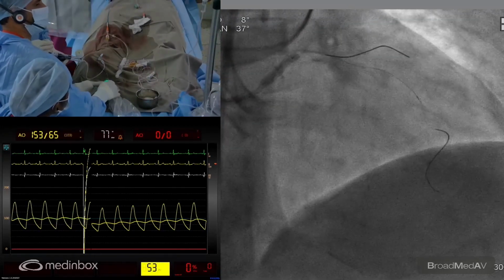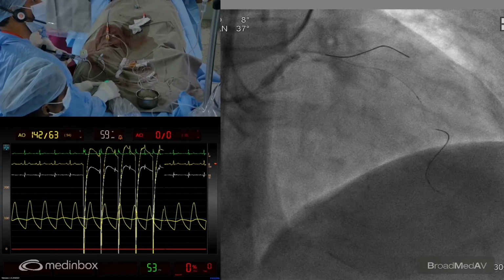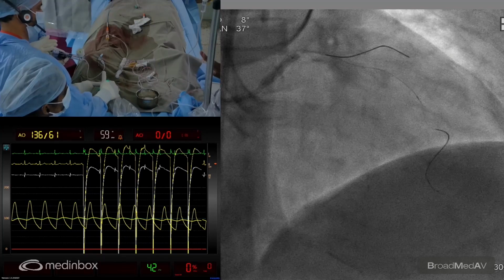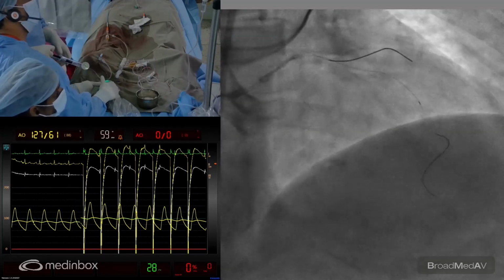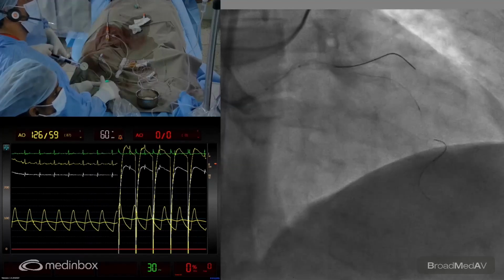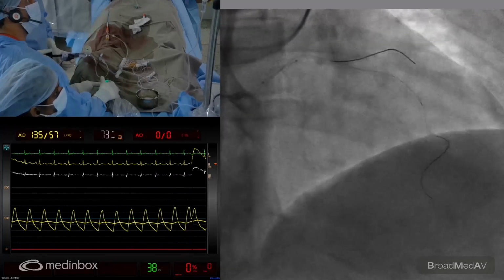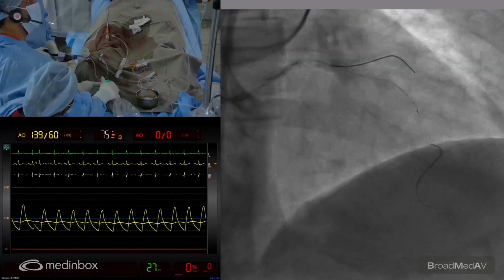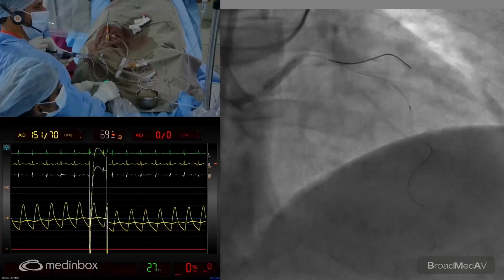Yeah, we are up to 4 now. Sir, please go, press continuously. Yeah. You can hear the noise now of the pulse, and you can see the pressure pulse there. Continue the pressure. And we saw the pressure fall. So we have deflated it. Now I'm going to inflate it again at 4. So we had 5 pulses, and now we go up again.